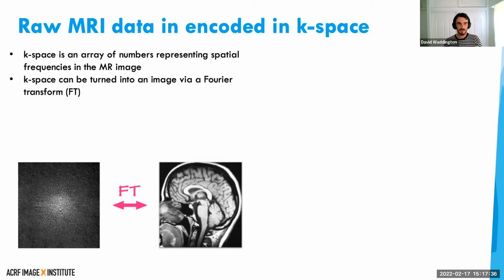But for those of you that have done a lot of maths, and I know we've got a few people from, say, a machine learning background with us this year, really what this is, is an inverse space. Because we are acquiring things that are in frequencies and have phase, all of our images are actually taken in this inverse space. And so the idea is to fill this inverse space that we call K-space and turn that into an image.